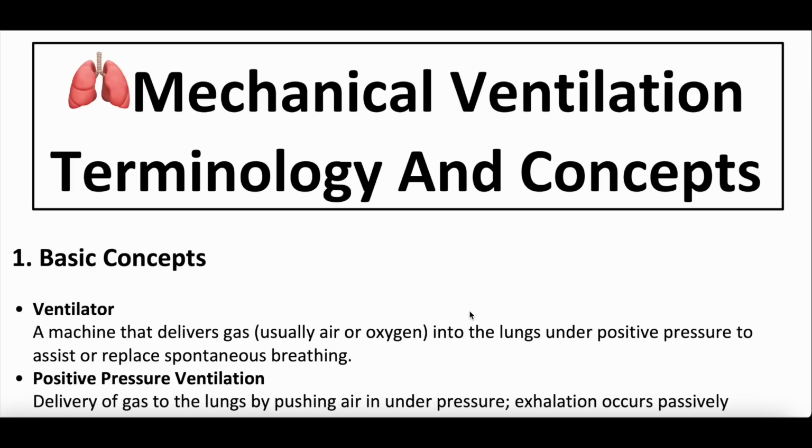We're going to start with basic concepts, literally what's a ventilator, positive pressure ventilation, PEEP, respiratory rate, tidal volume, all that good stuff. We'll then go into more advanced topics like different mechanical ventilation modes. We'll talk about alarms, scalars, and loops. We'll talk about more advanced topics like driving pressure. We'll talk about some of the more advanced ventilator settings like I to E ratios and flow rate and all that jazz. So a lot of good stuff packed into here.